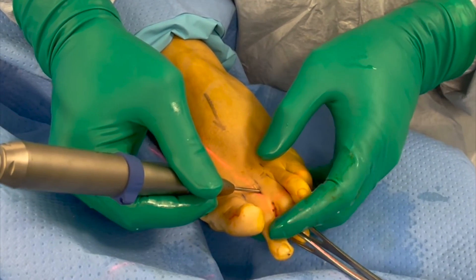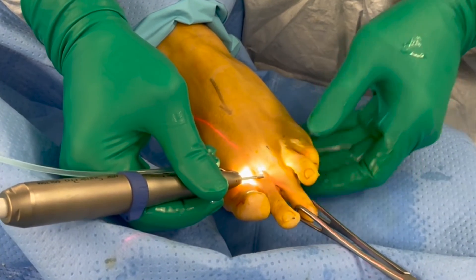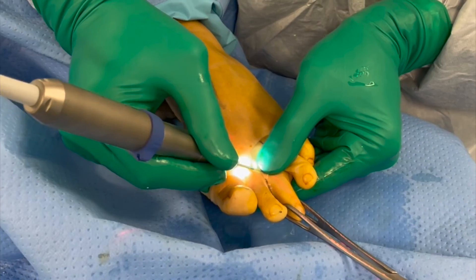The technique can also be applied to the other lesser toes, as demonstrated here on the third toe. The principles of the osteotomy when applied to the other lesser toes are the same as when applied to the second toe.